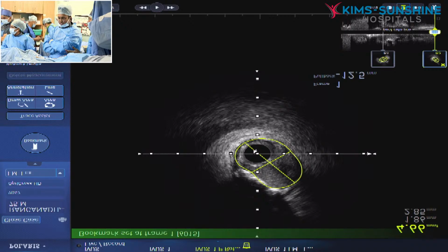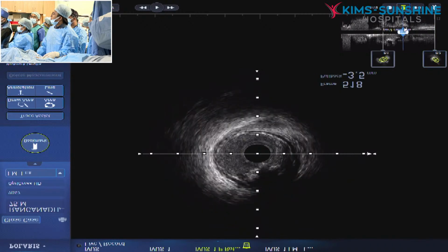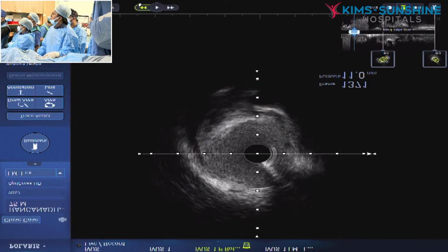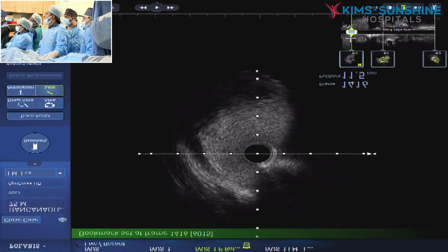It's a 2.5 area, and you can take 2.75. But 2.75 can go up to 4.5. That is also fine. We'll take 2.75. And length, what is the length from there? Total length up to left main, from distal end. No, mark distally length and then you take. Take a length, it will come. A line. Take line. Then go distally. What is the length?